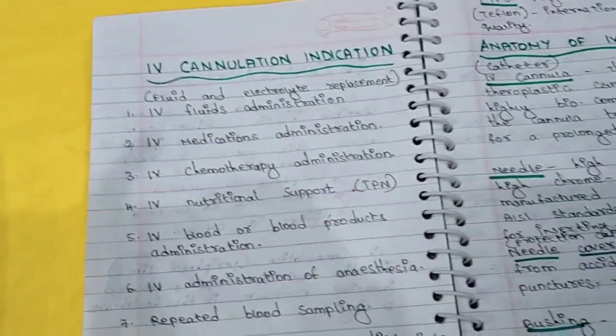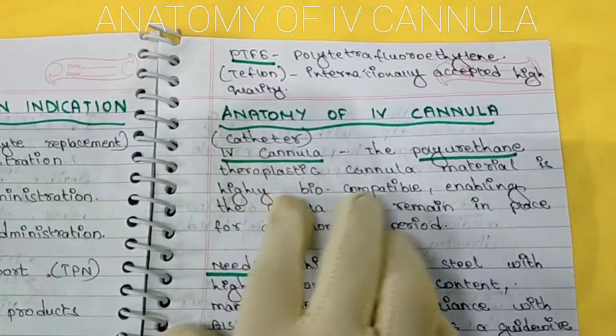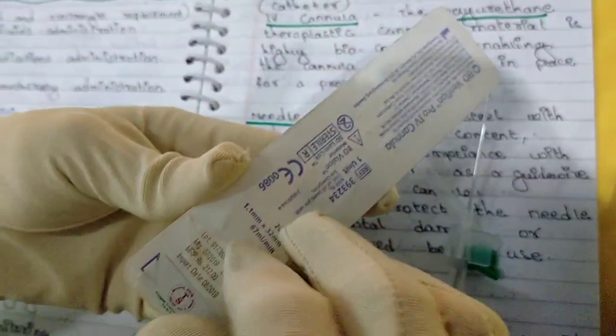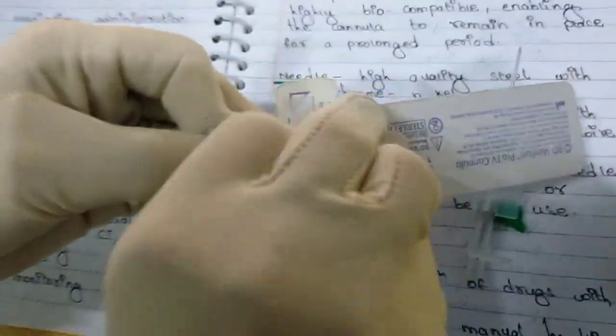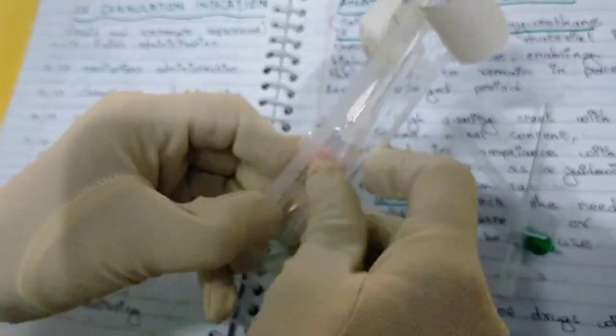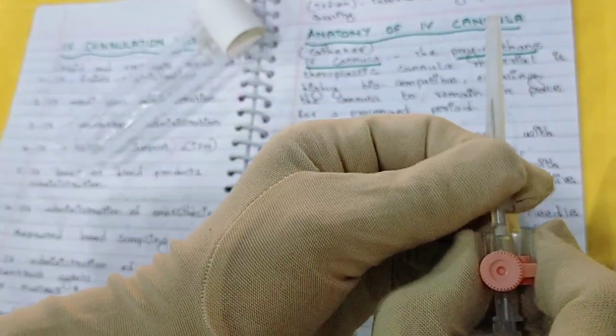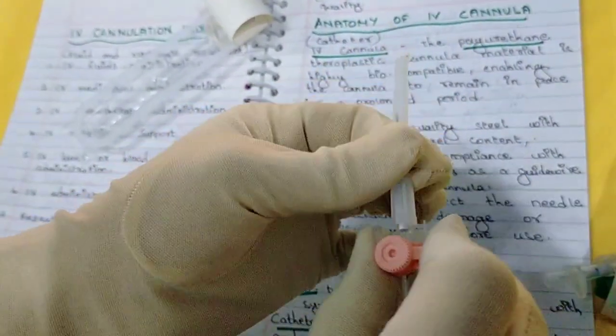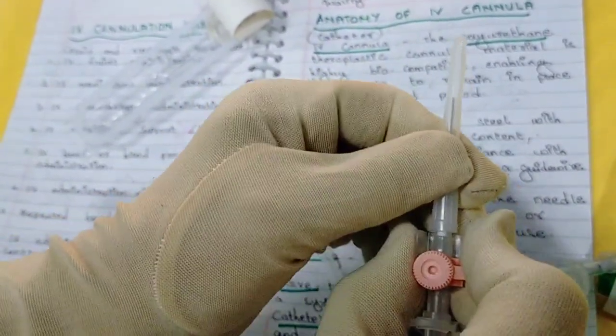Now coming to the anatomy of IV cannula. Just as we study the anatomy of different body organs, we need to know the anatomy of IV cannula to understand and deal with it better. Now let me open this — this is an IV cannula. When you open an IV cannula, the first thing is this protection cover or protection cap, also called the needle cover. This protects against accidental damage to the needle or accidental puncture, and it is removed just before use. So whenever we are going to use this cannula, we first remove this needle cap.